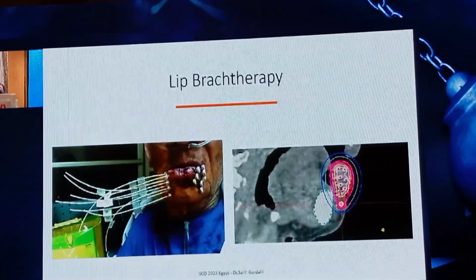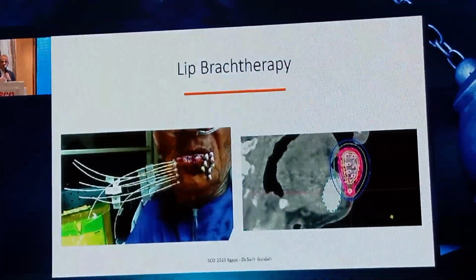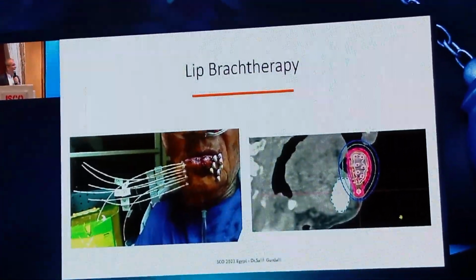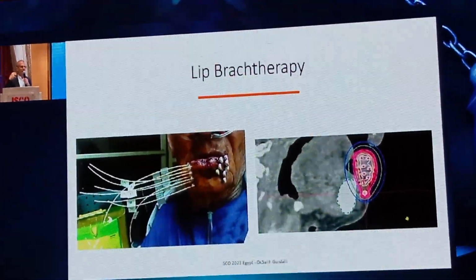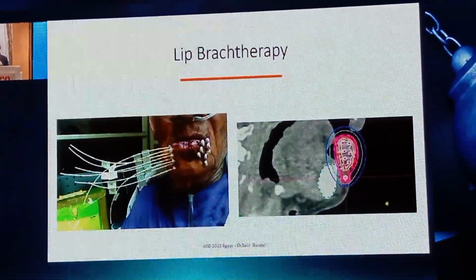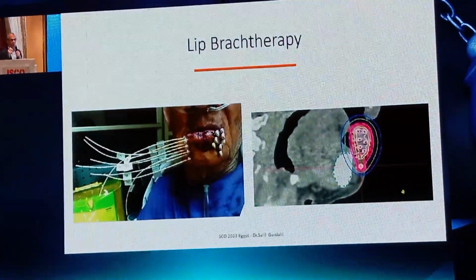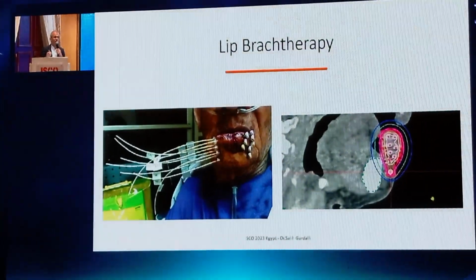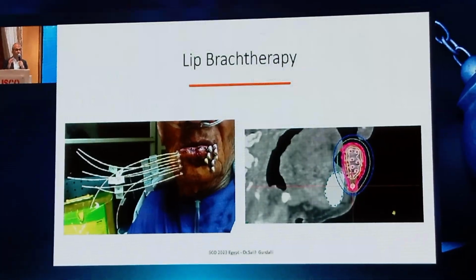Most of the time we are doing BID treatment, like 5 days, 7 days, BID, so the patient is getting fractions twice a day. That means the patient is coming back and forth twice a day for a week. You need to be sure that these catheters are packed correctly, because they're not going to keep them in the hospital. The patient is going to take them home and come back the next day. So we need to be sure that these numbers are right. For this, don't forget to take plenty of pictures. Maybe one day you might face a patient who says, oh sorry, I forgot, I dropped one. So which one is one? You don't know. The proper picture is a big deal.